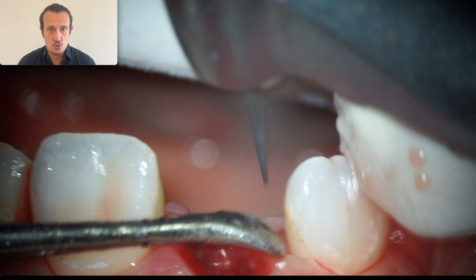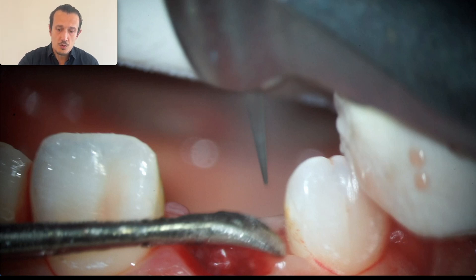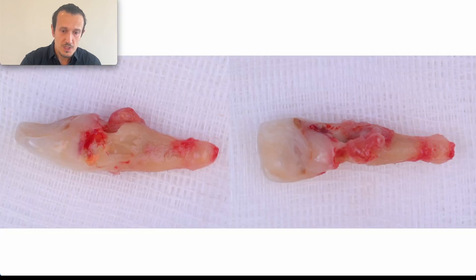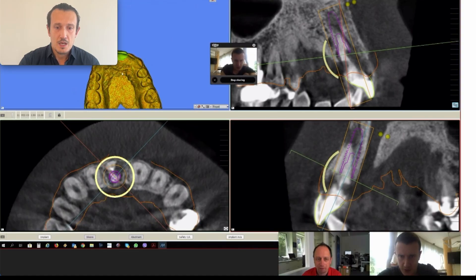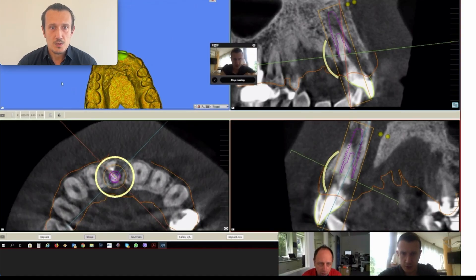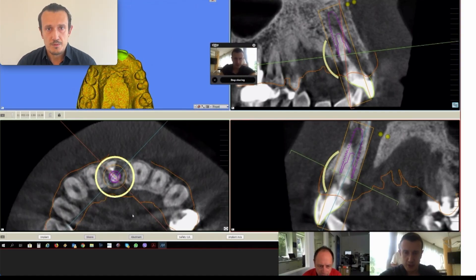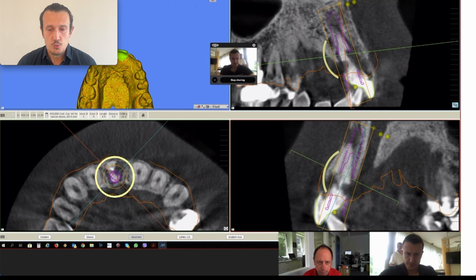This is the tooth and you can see that it's not savable, at least in my hands. We did the planning with Emil Bobov on Mesoft, and what we're looking at is that we have enough bone to place the implant and achieve primary stability.